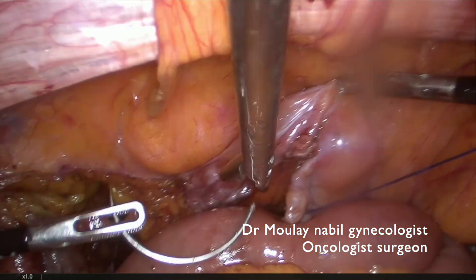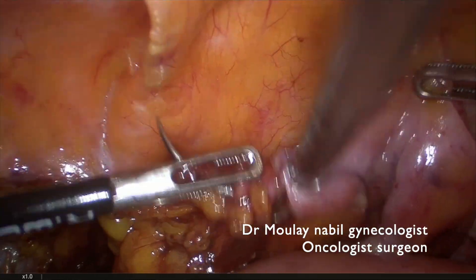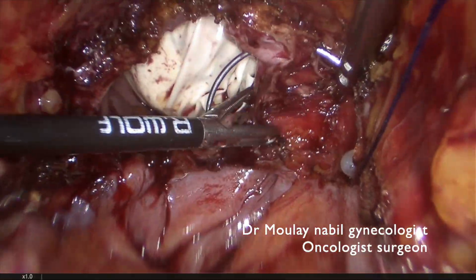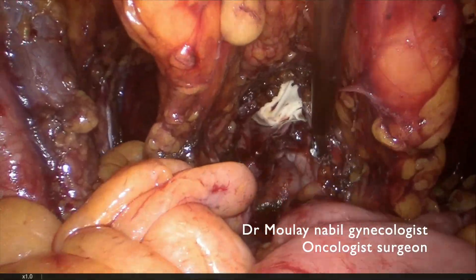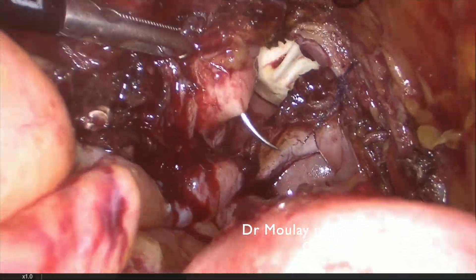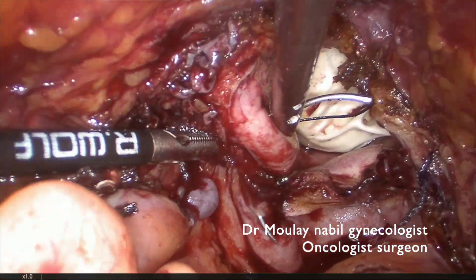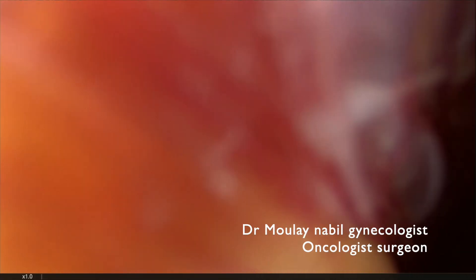For fatty patients, I recommend doing a stitch on the parietal peritoneum that allows us to pull up the entire peritoneum to have a better view of the vaginal cuff, because the assistant must fight with the bowel and the surgeon must do the entire suturing by themselves. I recommend in fatty patients to use the extra-corporeal suturing technique — you win time and you are more secure, because the assistant must pull the bowel up every time.